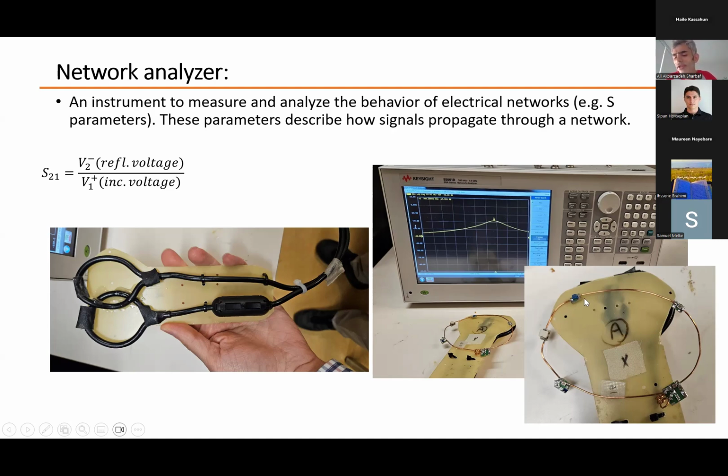We always use a variable capacitor so we can adjust the resonance frequency exactly to the Larmor frequency. While building the coil, we have to calibrate everything multiple times. We don't build it and just leave it. We have to calibrate it again and again and again, so we have to have some degrees of freedom.